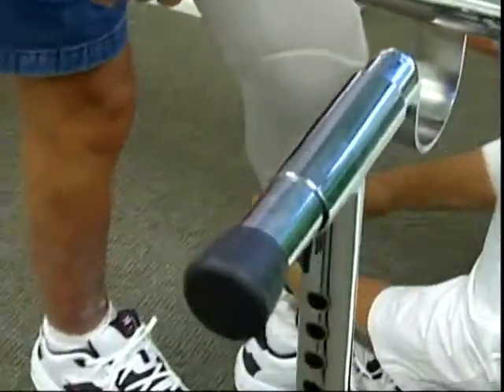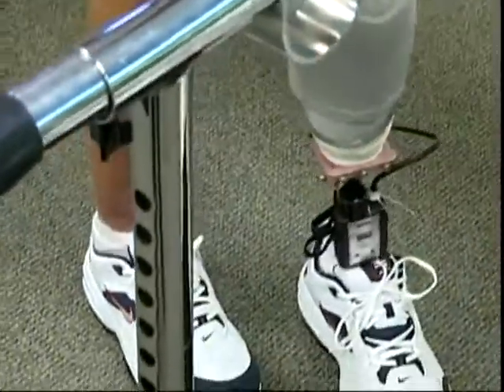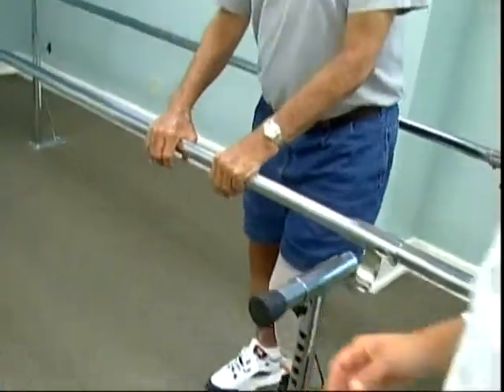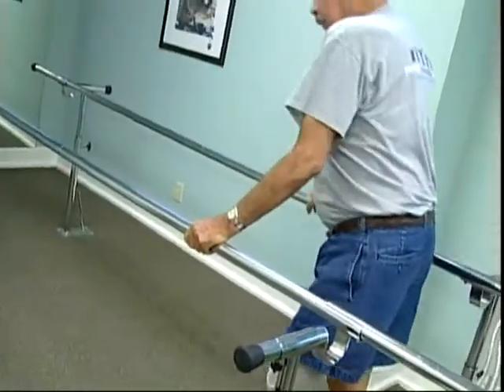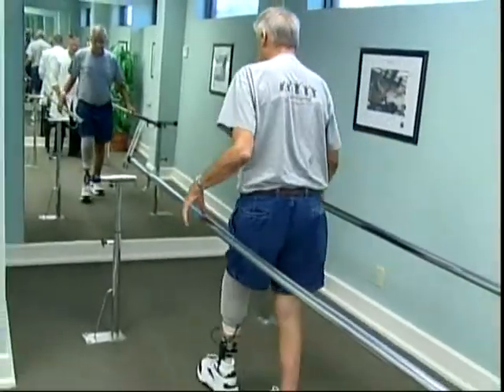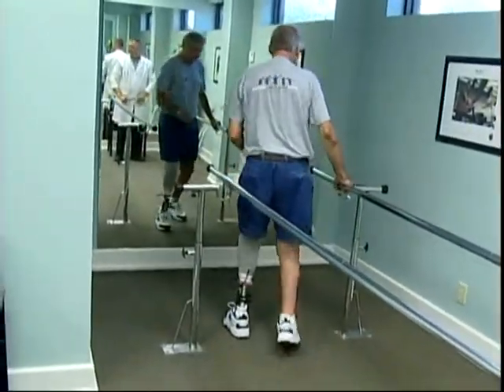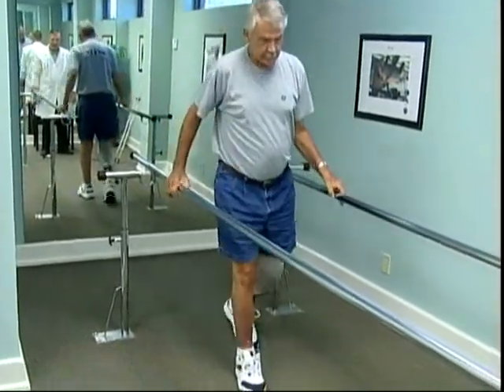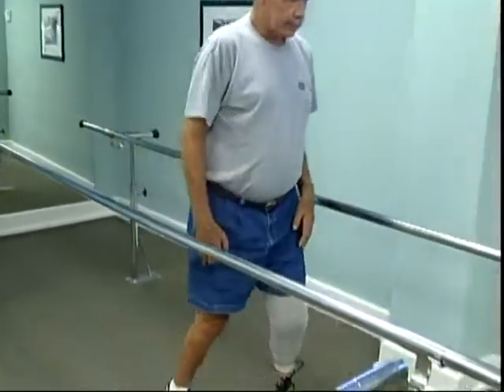Okay, so before we get too far along, I'm going to have you turn around, Tony, and let me take a look at your pelvis. We're going to get some cycling on and off from time to time. Yeah, I just heard the motor, so that was the vacuum making itself tighter again. That's correct. Anytime there's any seepage out of the system, it will automatically re-engage.